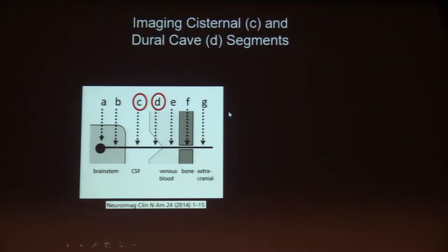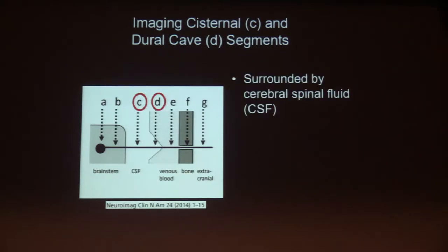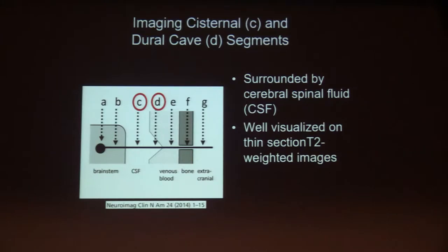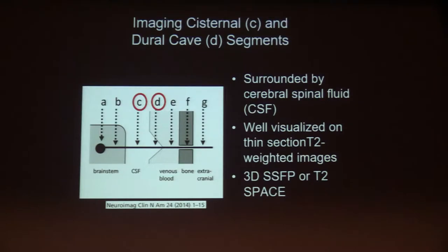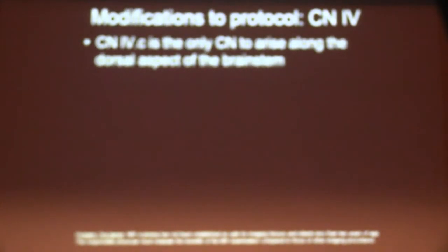The C and D segments are surrounded by cerebral spinal fluid in the subarachnoid space, and for this reason they are well visualized on thin-section T2-weighted imaging, no matter which technique is applied. You can use 3D steady-state free precession imaging — CISS, Fiesta, balanced fast field echo — or a more typical spin-echo T2-weighted sequence like T2-SPACE, which will also allow visualization of the cisternal and dural cave segments.